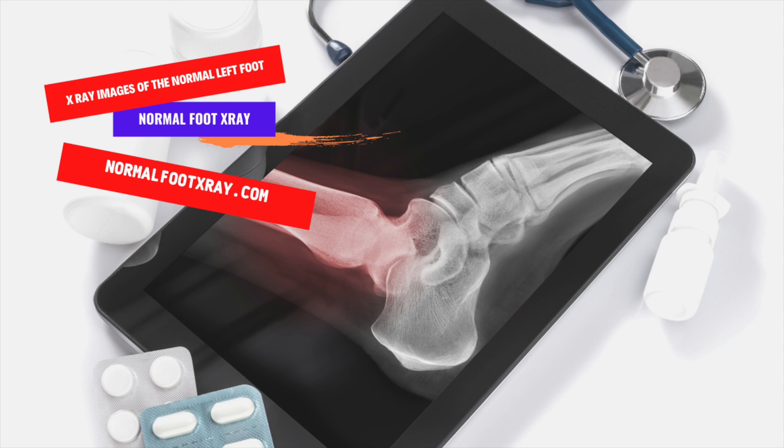Anteroposterior X-ray images of a normal left foot can detect broken bones and dislocated joints, and can be helpful in planning surgery and evaluating its results. An X-ray of the foot can also detect fractured bones, dislocated joints, and other conditions affecting bone alignment. It can be used to plan and assess the effects of surgical procedures, as well as to diagnose tumors, cysts, and late-stage infections of the bones.